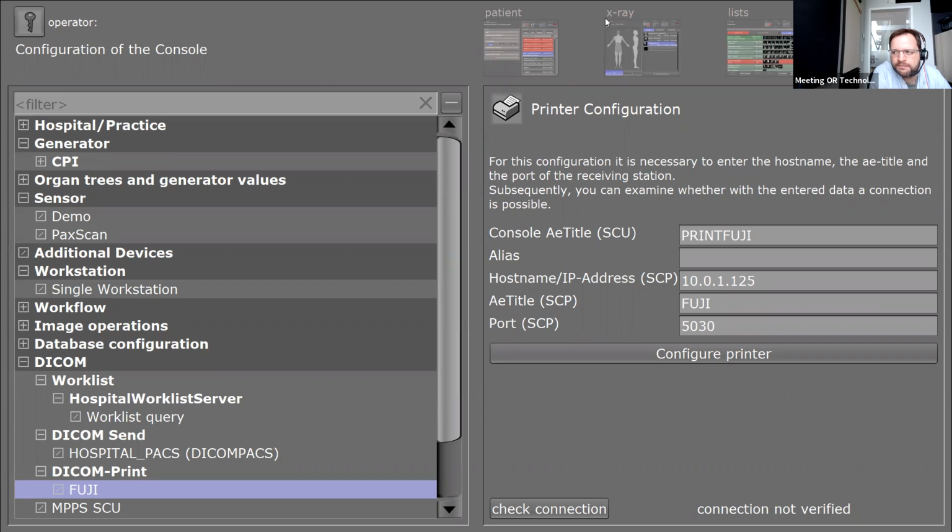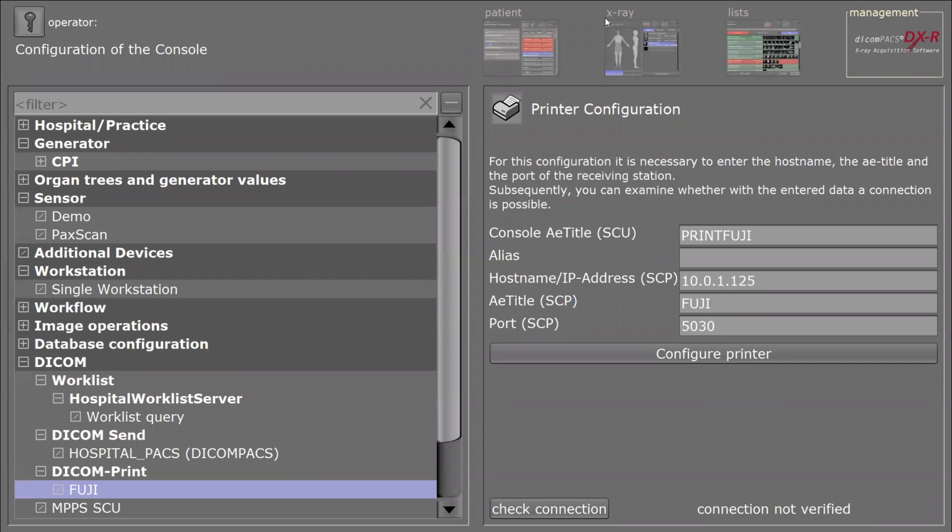Connection to a printer? Yes, printer, and okay, we have Amadeus here, and you can connect to it via TeamViewer. Yeah, sure. Yeah.